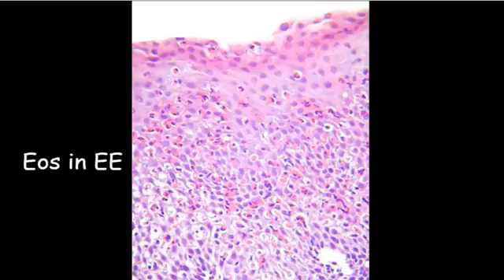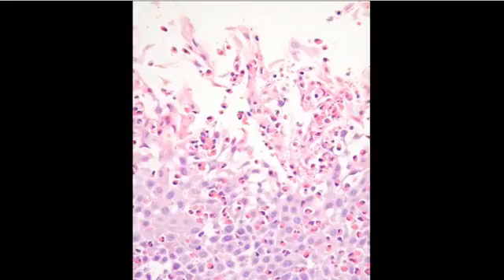And this actually now can be measured endoscopically with some sort of impedance device. And so the gastroenterologist may actually be able to measure this up and down the esophagus and predict whether it's eosinophilic esophagitis or reflux based on the distribution of this spongiosis. So they may put us out of a job. And here you can see these exuberant little superficial micro abscesses of eosinophils. And this was one where the endoscopist clearly saw little white dots in the esophagus.